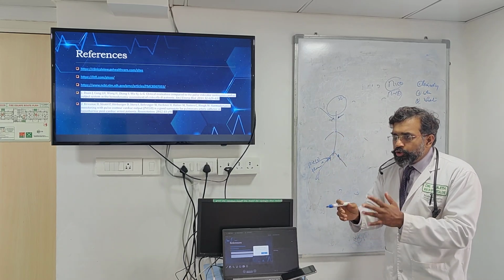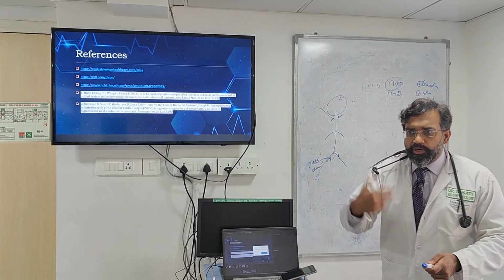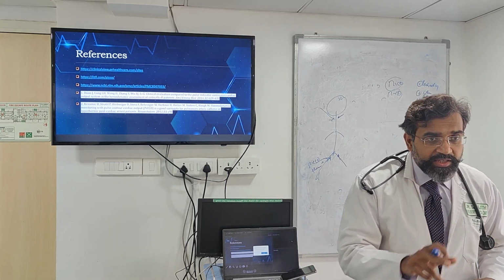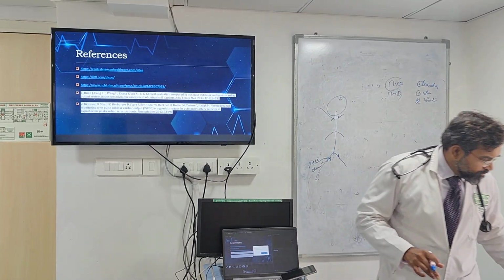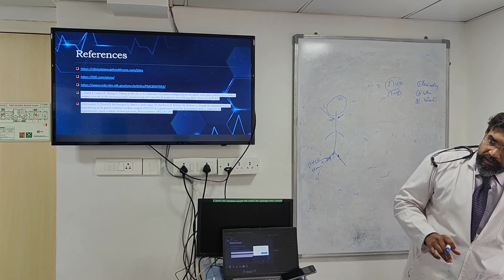So my dialysis line should be separate, not in the same circuit as my thermodilution. Samajh mein aa raha hai? This is very important, because if you do something like that, you will have all kinds of problems. But we can insert a right IJV CVP and a right femoral Picco line. That is fine.